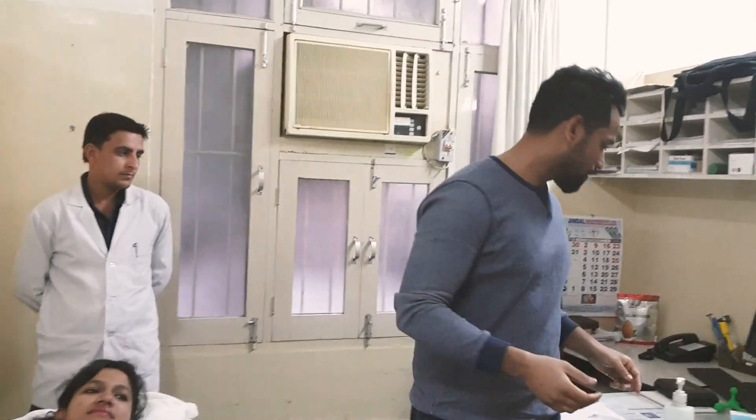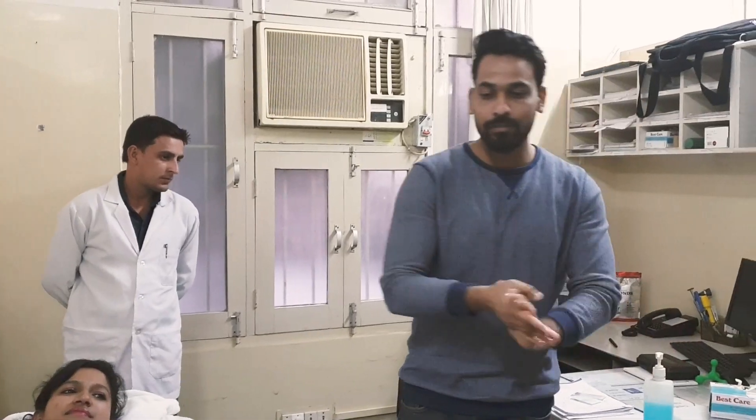Hi everyone, again we are here on the channel of Elite Institute of Manual Therapy. In today's video we will discuss the dry needle procedure for the lower leg. First we will look for the trigger point of tibialis posterior.